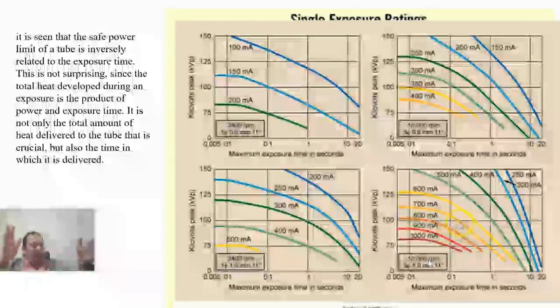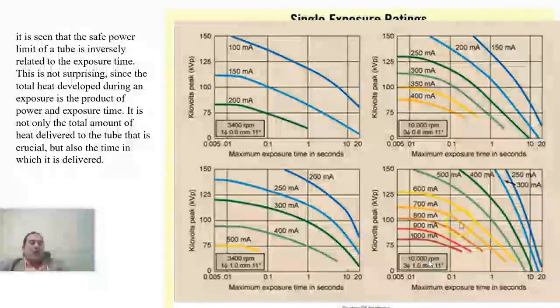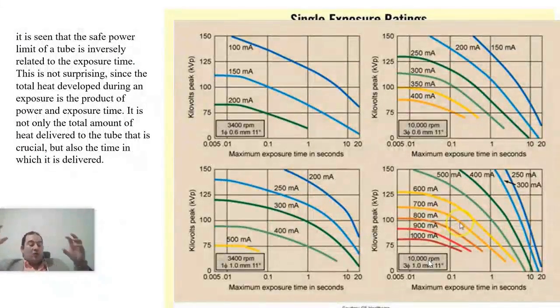When we talk about dose optimization, the kV, milliampere, and their relationship come into play. There are other parameters. I have 5 parameters in computed tomography that affect the patient dose: kV, milliampere, rotation time, pitch factor, and something called beam collimation. These are the 5 main factors that affect the patient dose.